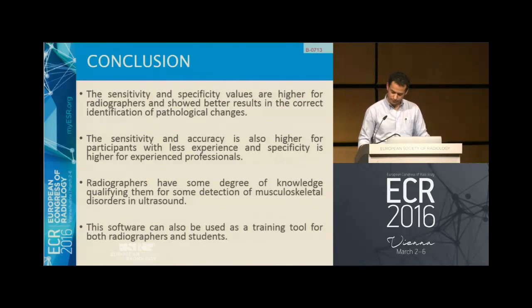So, in conclusion, as expected with our initial hypothesis, results are generally higher for radiographers and also higher for participants with less experience. Radiographers have some degree of knowledge qualifying them for the detection of these diseases in ultrasound, and we think this software can also be used as a training tool for both radiographers and students when they're going through their degrees.